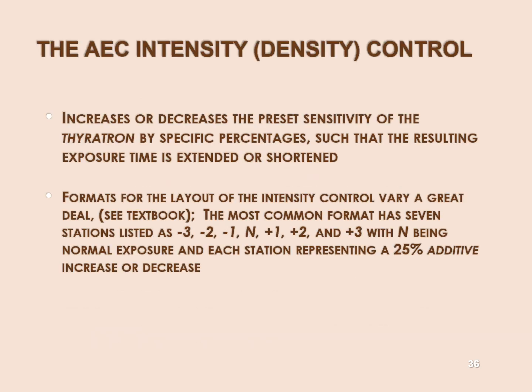So density and automatic rescaling. Density was made for screen film technology where the exposure actually determined the brightness or darkness of the film. Okay. It doesn't make sense anymore. It's completely obsolete in digital technology. CR and DR both have a software subroutine that you're going to learn about this spring called automatic rescaling.